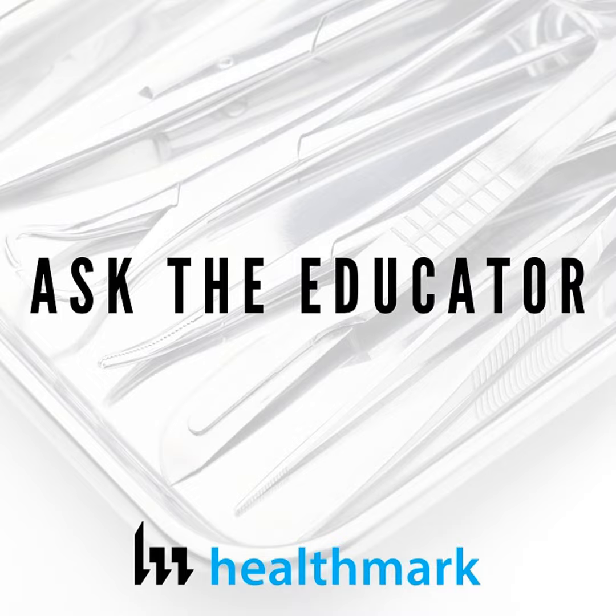However, you don't always hear of these infections, especially those of us who work in sterile processing. So it's one of those things where I'm glad that you knew about it, only because unfortunately that message doesn't always get back to sterile processing where all the cleaning takes place. That being said, I've done a lot of visits now. It's somewhere in the 20s, like 22, 23 shavers that I've inspected over the past couple of years, and every single one of them had visible debris in them.